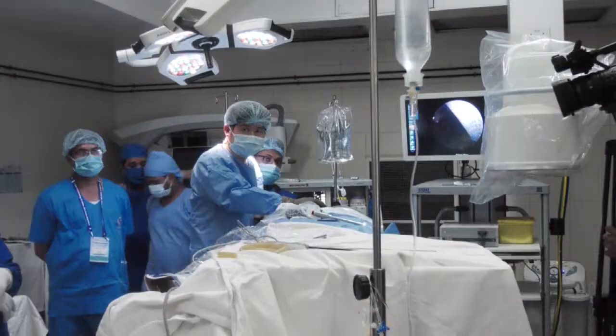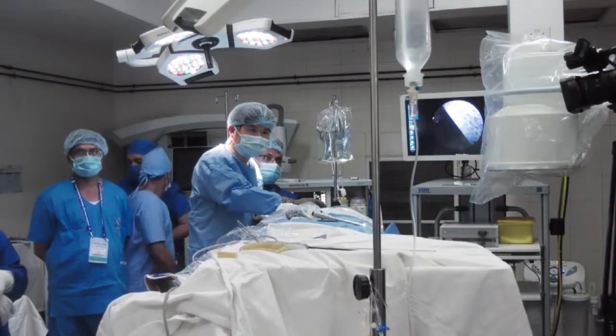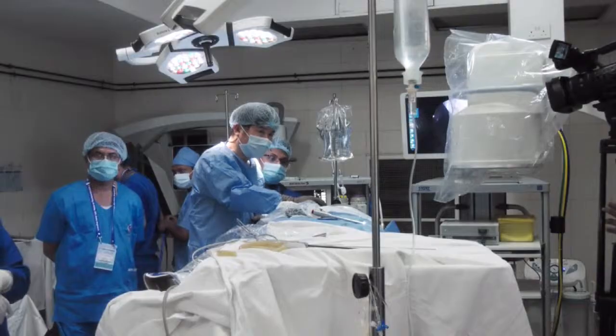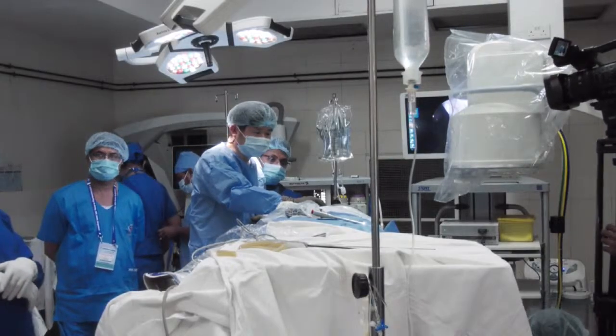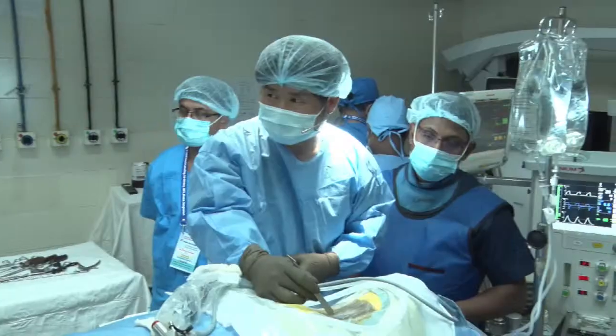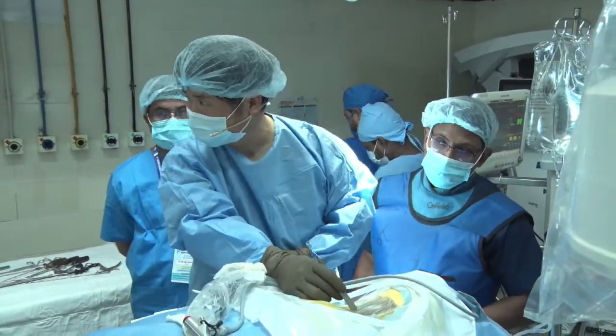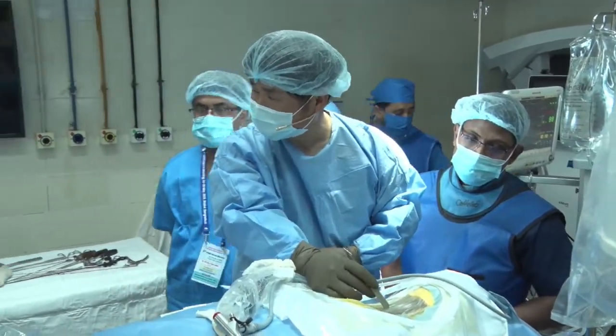Usually with the small scope the skin incision is transverse, but with the large scope it is a vertical skin incision. Today I use the large scope, so I will make the vertical skin incision.